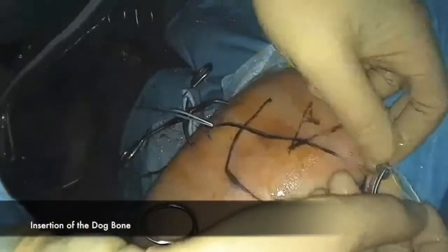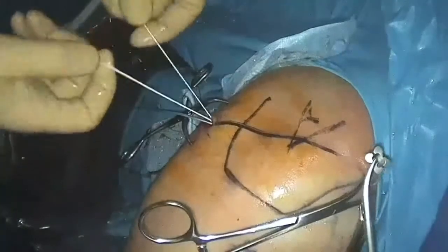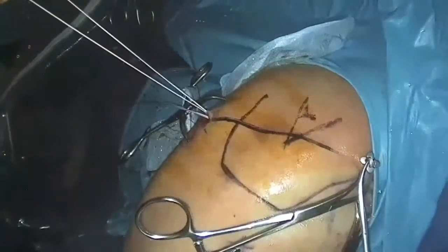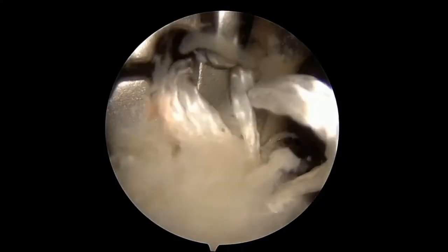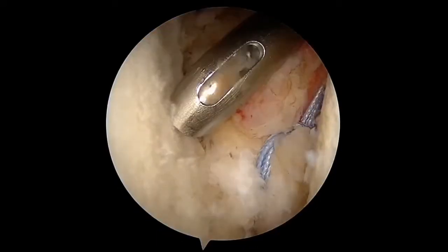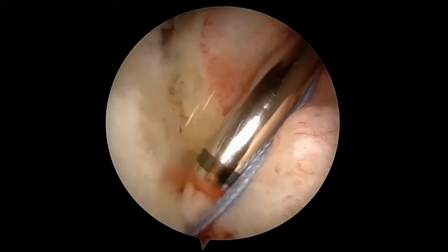A cortical button is shuttled from posterior to anterior through the glenoid and from inferior to superior through the coracoid process utilizing the previously drilled tunnels. A second cortical button is inserted on the strands exiting superiorly through the coracoid process, and pulled into place via the posterior portal sutures until secured on the superior aspect of the coracoid process. A standard Bankart repair is then performed, taking care to advance the inferior glenohumeral ligament in an effort to restore stability.